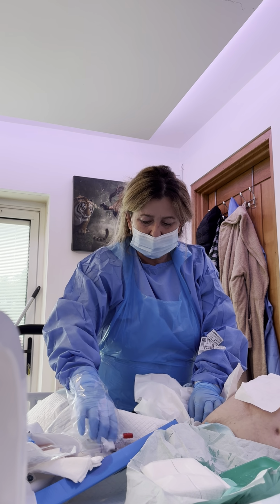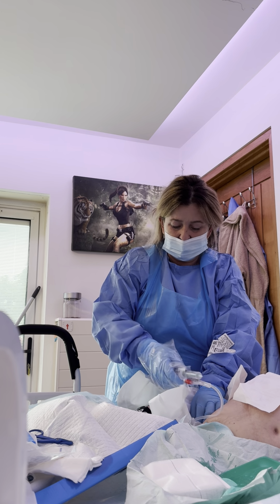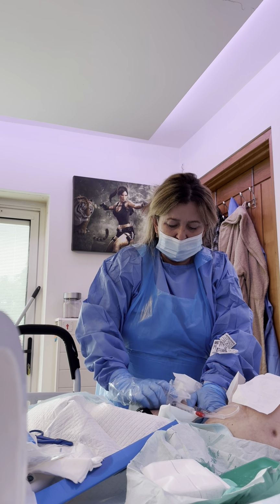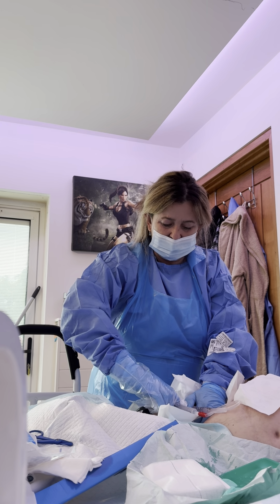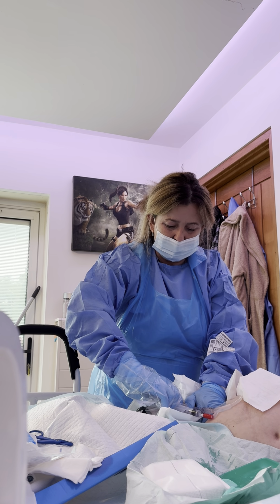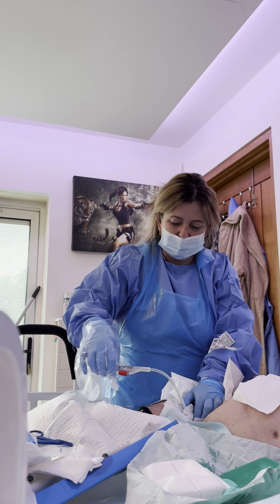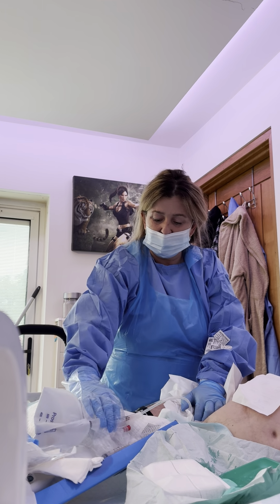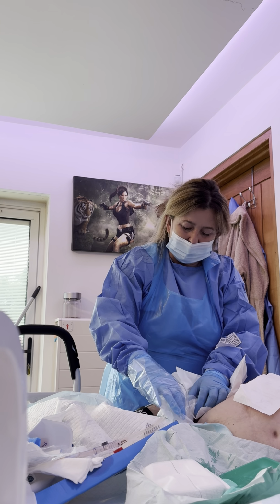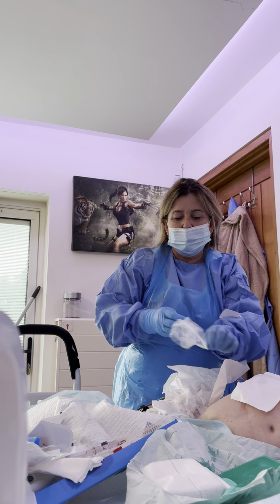You alright? Yeah. And then I'll take this and take some big breaths then. Once I've got this in, which is your 10 mils, you push it through your nozzle. You don't need sterilised gloves onto this. And you just pop that in there. And take that off, take your catheter, push it over, pull it down so you've got an actual flow, and you give that a little tiny tug. Look, I'll bring the camera again. Yeah, let me de-glove off.